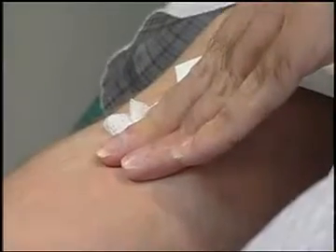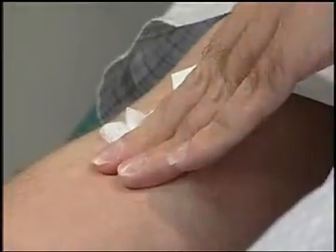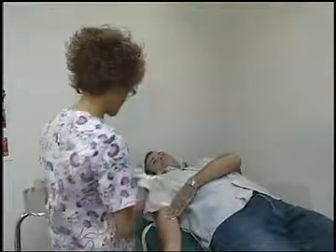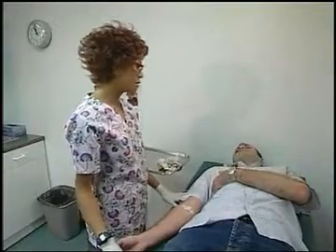And don't forget to check on your patient. How you doing, Mike? Fine. Let's keep the gauze on for a little longer, and then I'll apply a Band-Aid. There you go, Mike. You can leave whenever you're ready. What about the results? The doctor will call you in a couple of days.